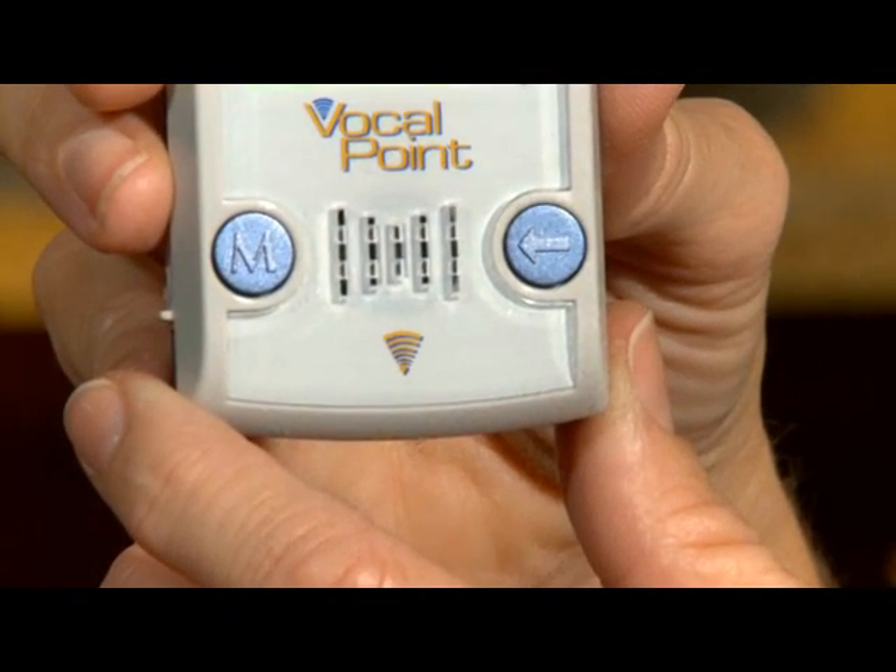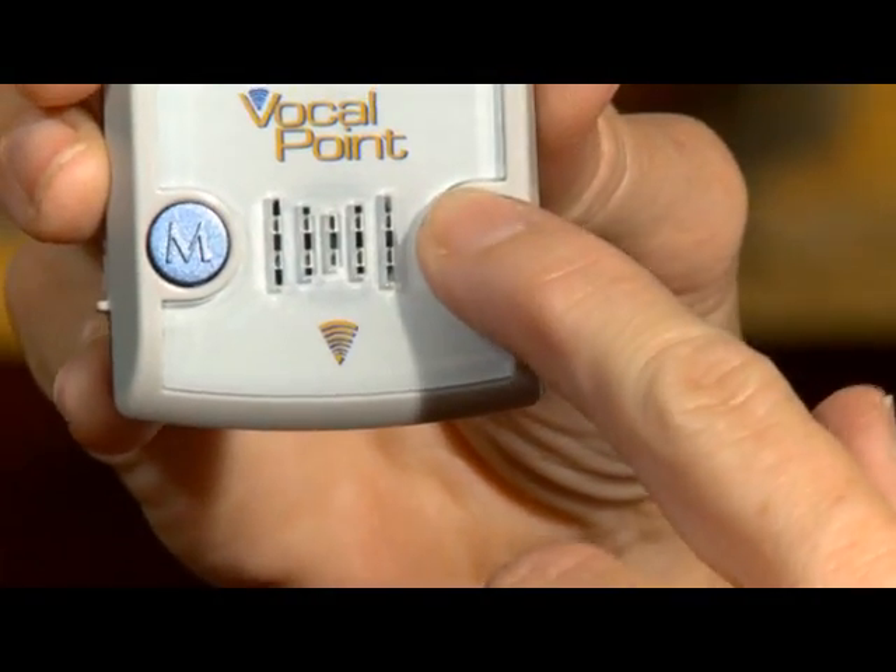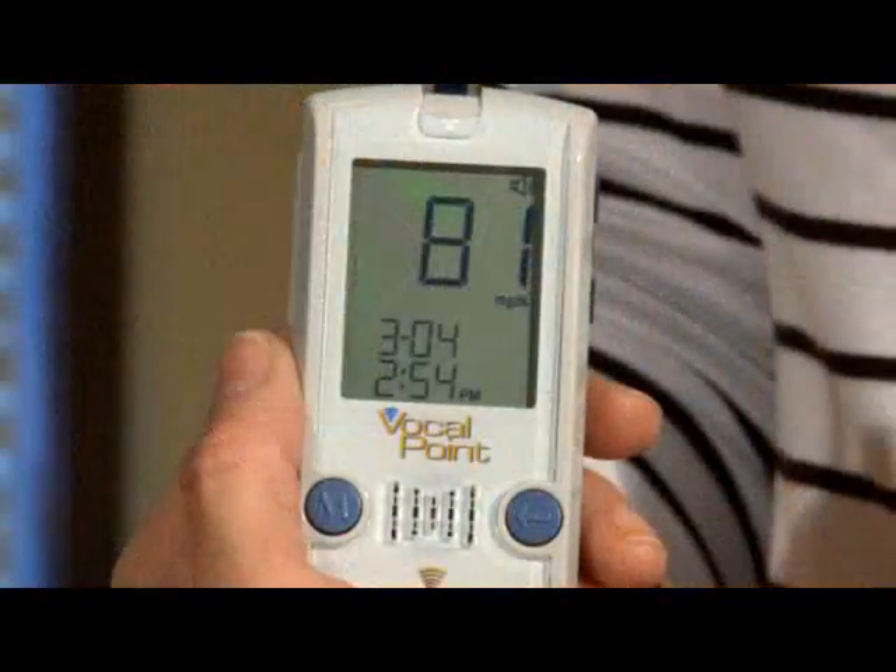Another great feature of the Vocal Point meter is the repeat button. While the result is displayed on your meter, push the arrow button to repeat this result.